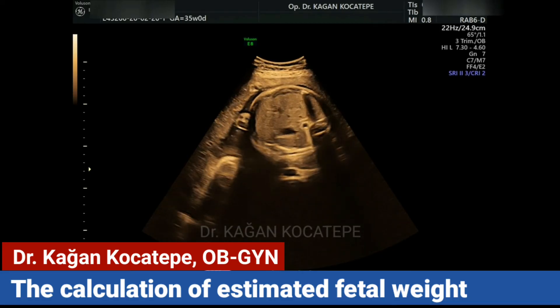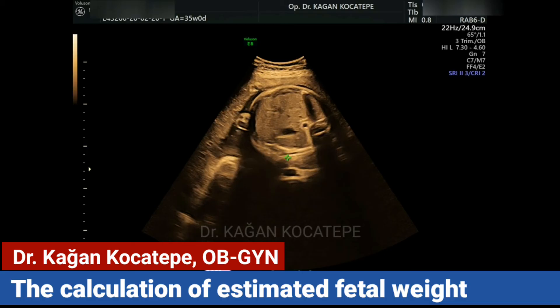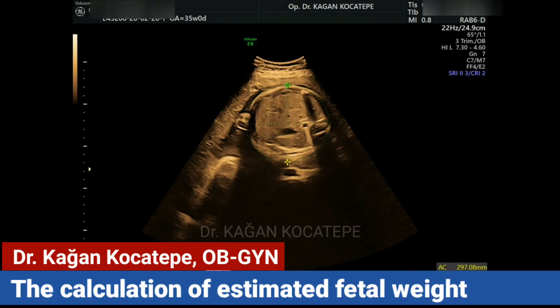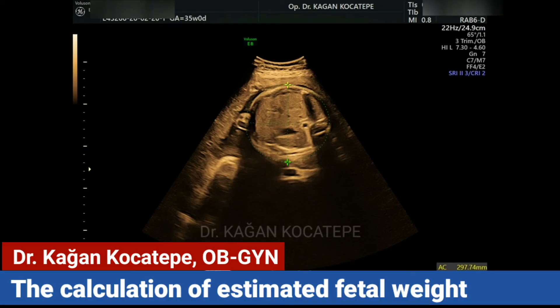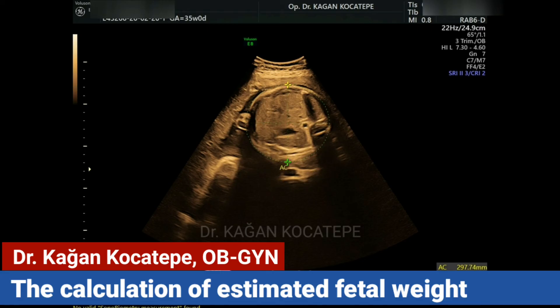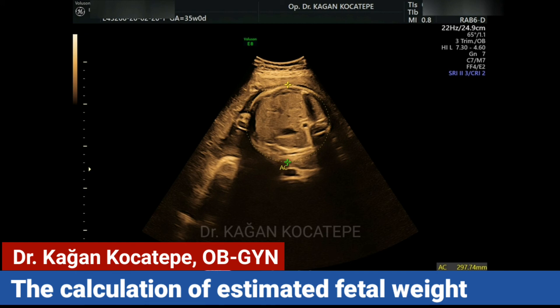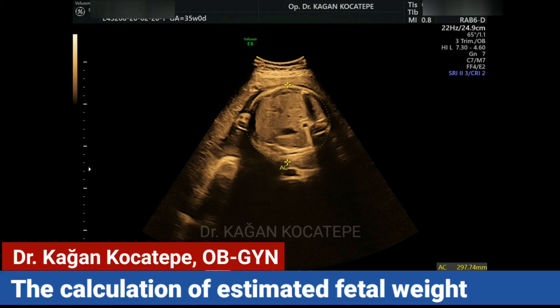We measure after these four measurements, and the ultrasound machine makes a calculation and gives us the estimated fetal weight, which is plus or minus 10 percent in deviation.